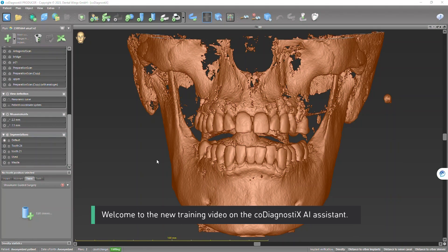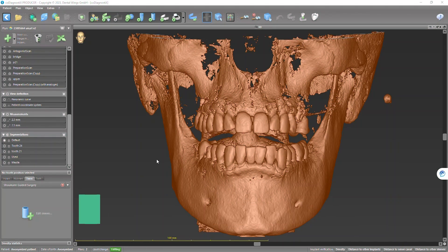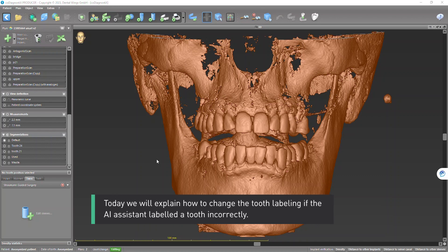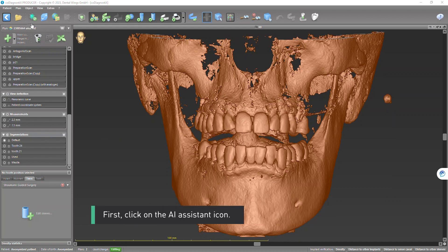Welcome to the new training video on the co-diagnostics AI assistant. Today we will explain how to change the tooth labeling if the AI assistant labeled a tooth incorrectly. First, click on the AI assistant icon.